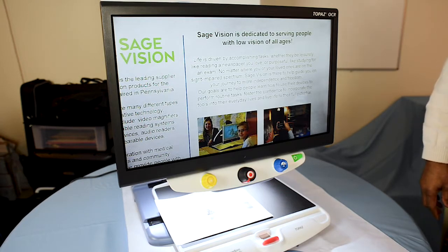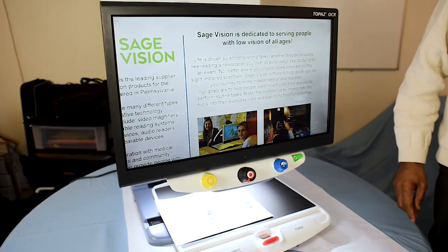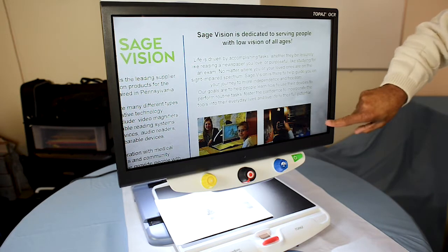To access the OCR feature, as I mentioned, it is a touchscreen. You touch the bottom right-hand corner of the screen.